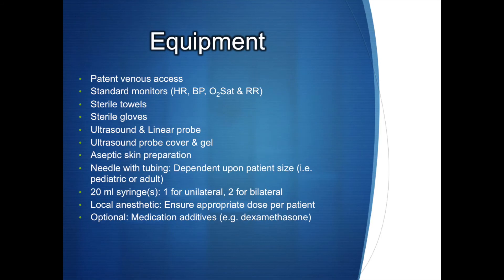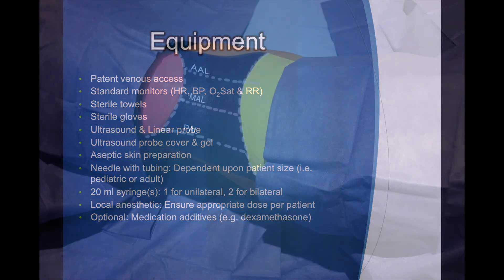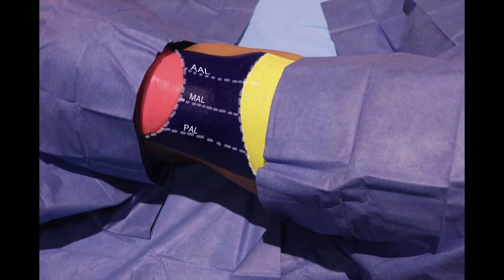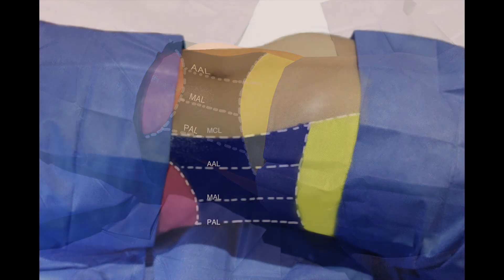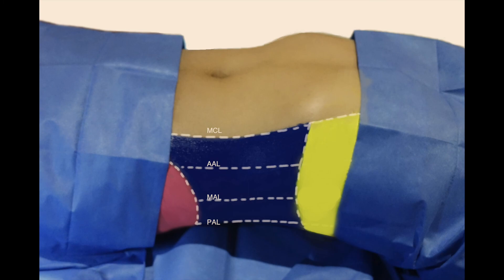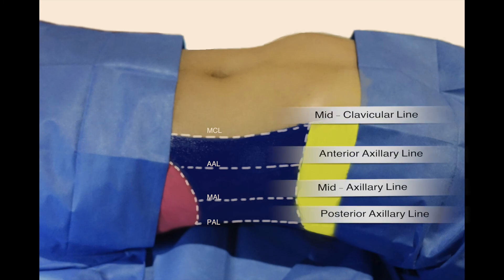This is a list of equipment needed to perform a TAP block. The TAP block can be performed after induction of anesthesia or in the post-operative setting. We will be demonstrating the ultrasound-guided lateral TAP block. First, place the patient in the supine position.